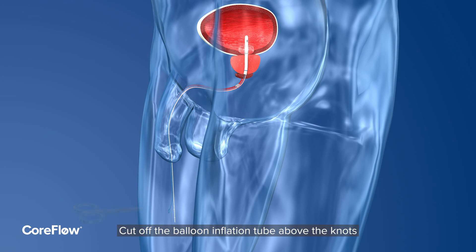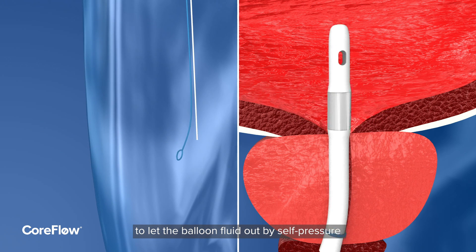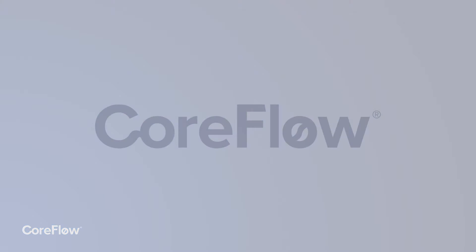Cut off the balloon inflation tube above the knots to let the balloon fluid out by self-pressure. Carefully remove CoreFlow by pulling the thread.